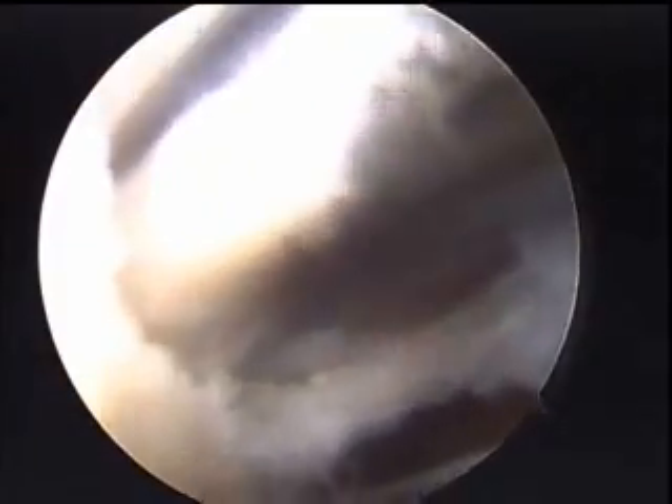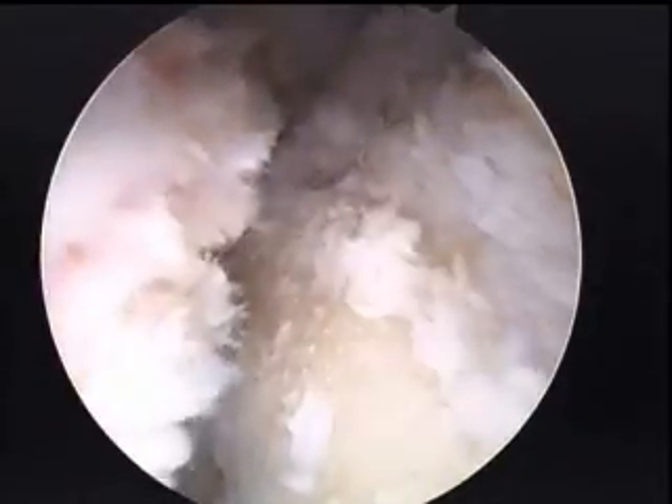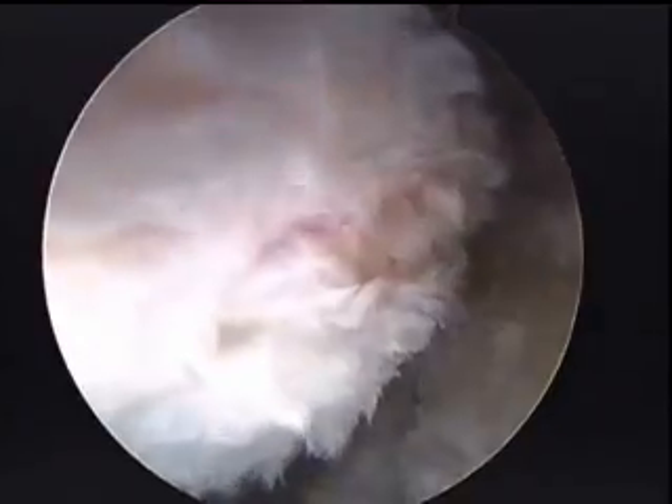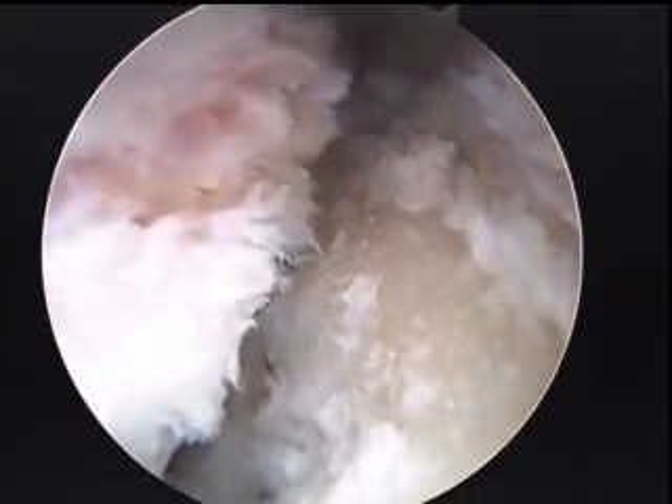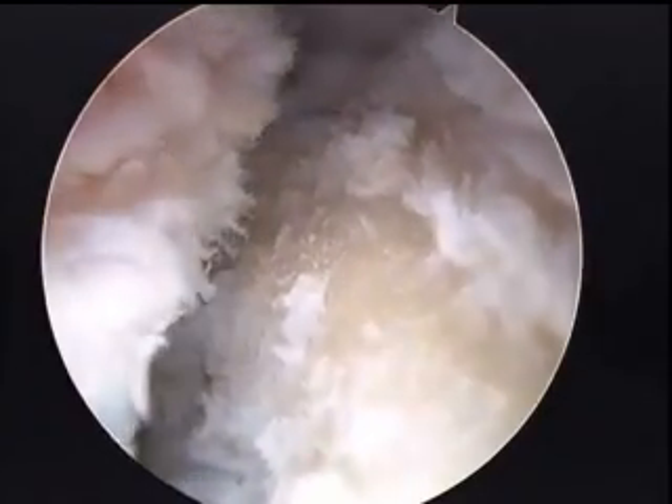Here we're just changing our camera view to look more laterally on the acetabulum, still at the rim of the acetabulum. The labrum is there on our left, that is bone on our right, and if we look down in the center there, that is the cartilage defect from the delamination.